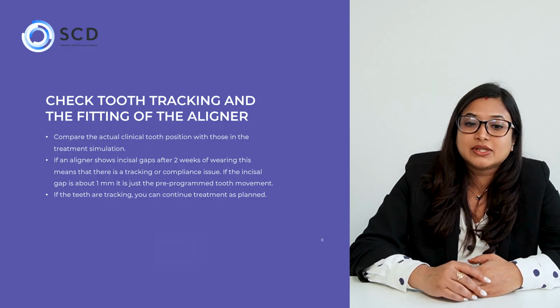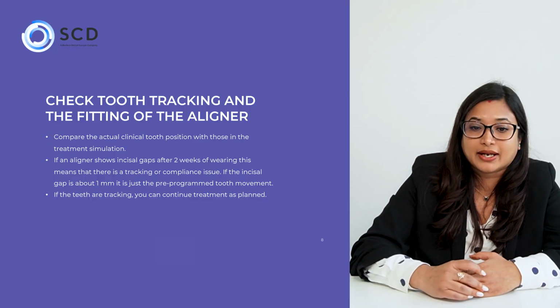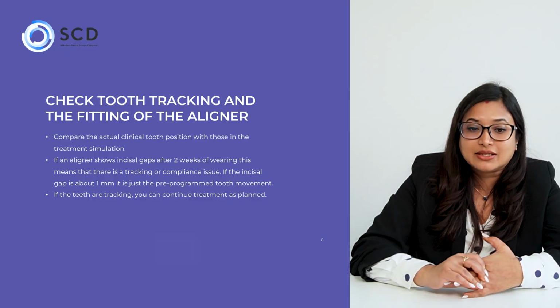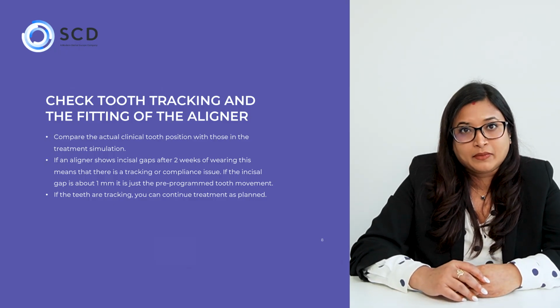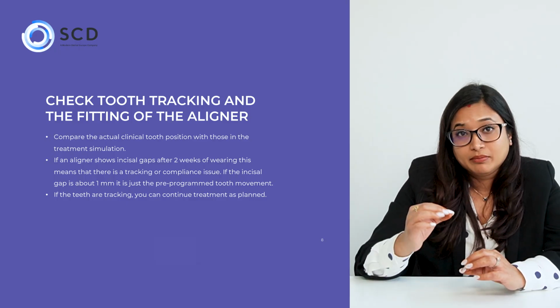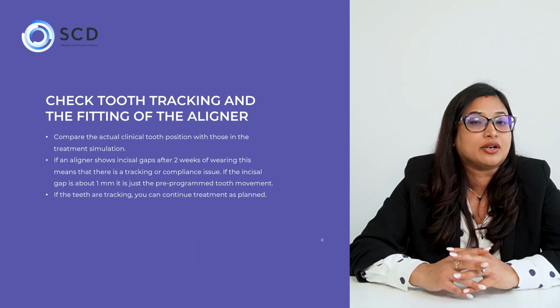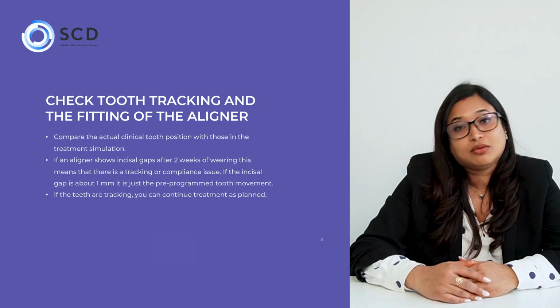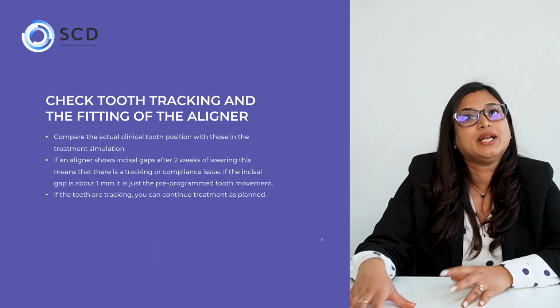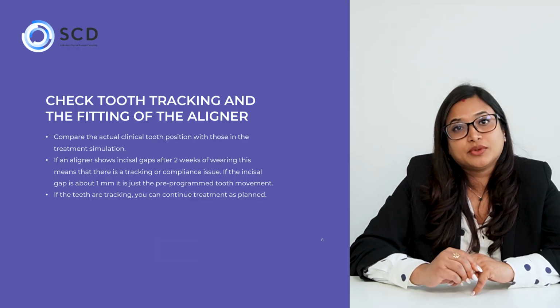If an aligner shows incisal gaps after 2 weeks of wearing, it means that there is either a tracking or compliance issue. If the incisal gap is about 1 mm, it is just the pre-programmed tooth movement. If the fit is not good enough and you can see a gap between the aligner and the incisal edge of the anteriors, then probably it's not going as per the tracking. If it is 1 mm, then probably it's not that much. It's just the treatment protocol which we are following, and over a period of time, it will be rectified. If the teeth are tracking, you can continue the treatment as planned.